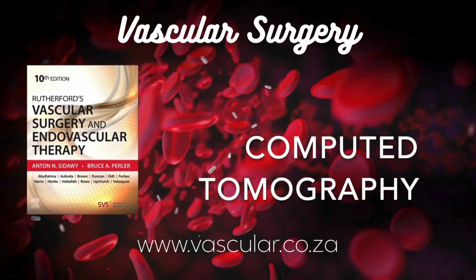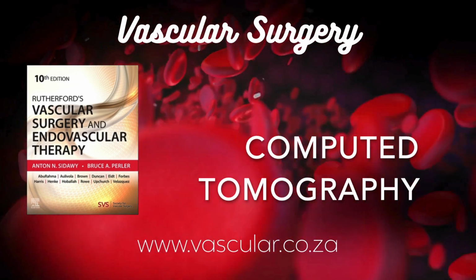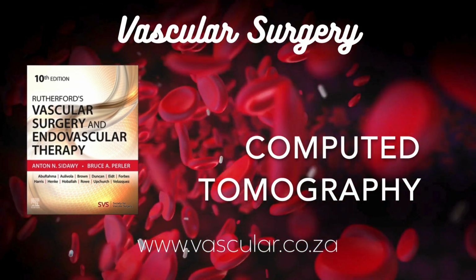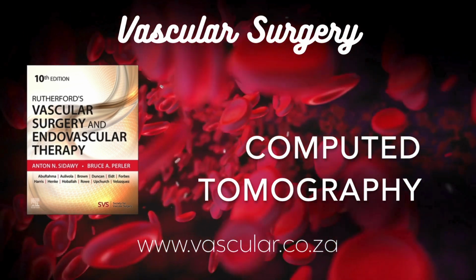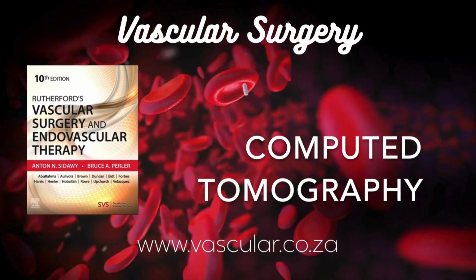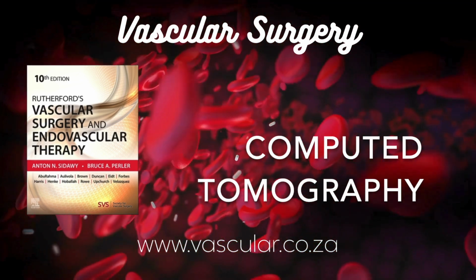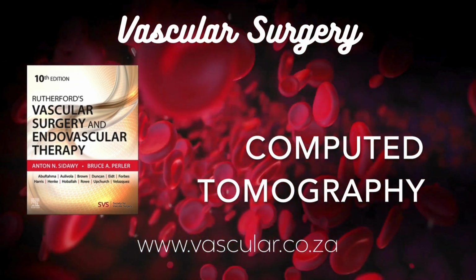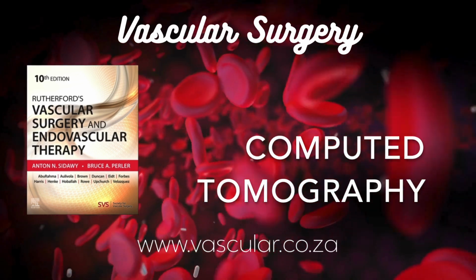So let's start way back. What was the original problem CT was trying to fix? Well, the big issue with standard x-rays, the basic ones, is that everything inside you gets superimposed, all stacked up on one flat image. Right, like trying to see individual instruments in an orchestra pit from the balcony, like a big jumble. That's a good way to put it. Yeah, you lose all the depth, all the separation.